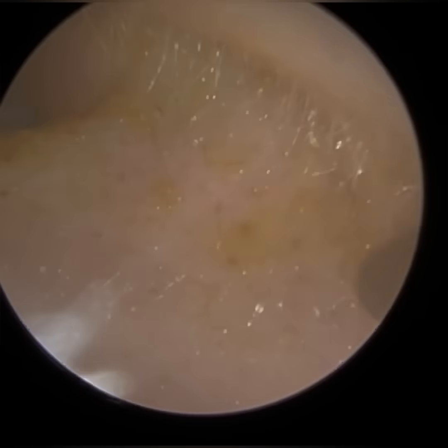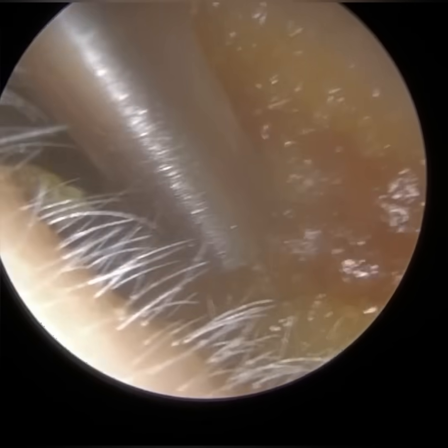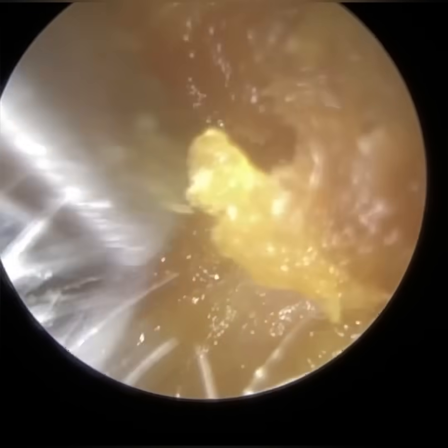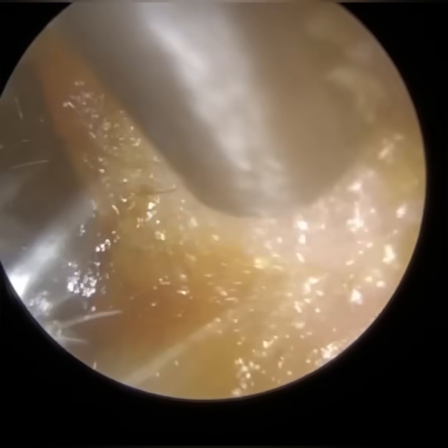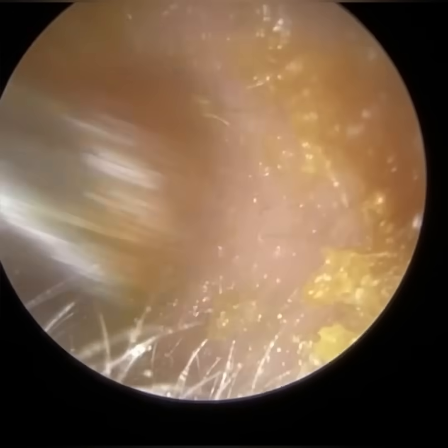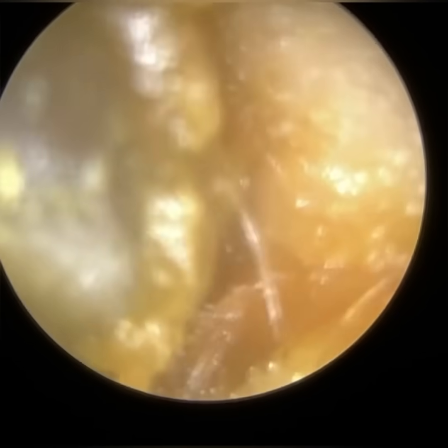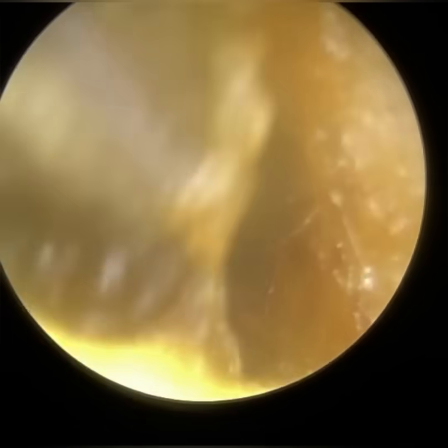The main handle — the main stalk — we call that the manubrium. At the top of the main handle of the hammer bone, you have a spherical section of the bone which we call either the lateral or short process. Then you have the neck of the malleus, which sometimes is not visible.